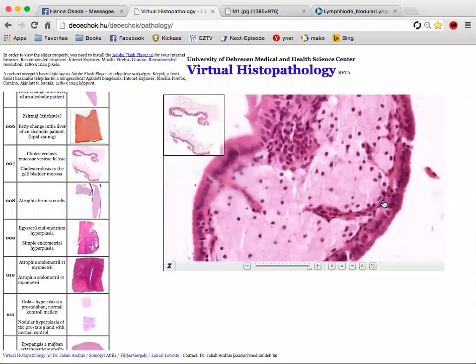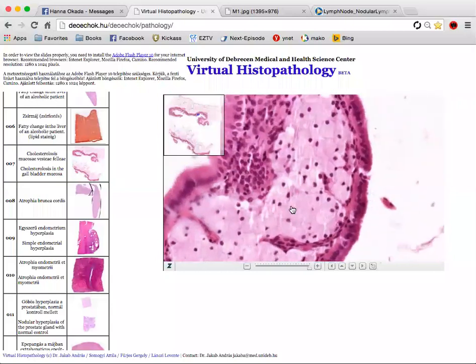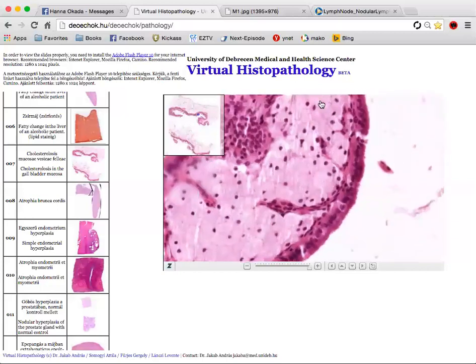And what's pathological here is all of this area, all the lamina propria, is occupied by these really big fluffy cells. So these are foam cells. They're macrophages that ingested a lot of cholesterol. We can see the macrophage here. This is one, and this is one, and this is one. You can't really see their outlines very well. They're very big. This is the same thing that happens in atherosclerosis in vessel walls. So all of these are macrophages.